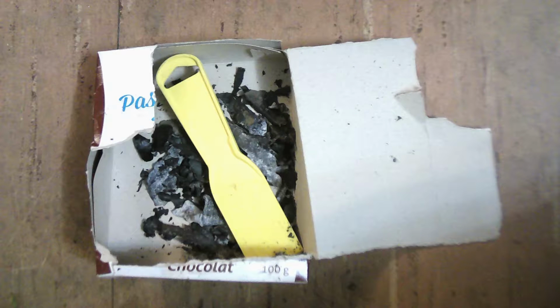a trowel to scrape the paint off after paint stripper penetrated the remaining manufacturer paint, and since I was working outside, a cardboard box to contain the flakes as they came off the hubcap from the manufacturing paint. To clean off the hubcap paint after paint was scraped off, I used alcohol swabs.